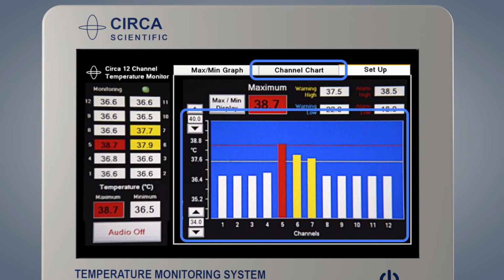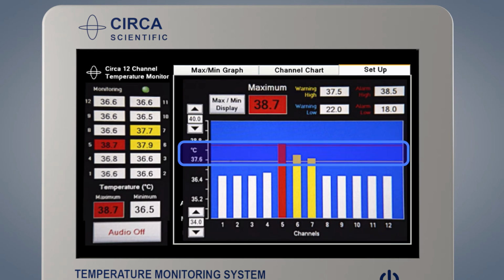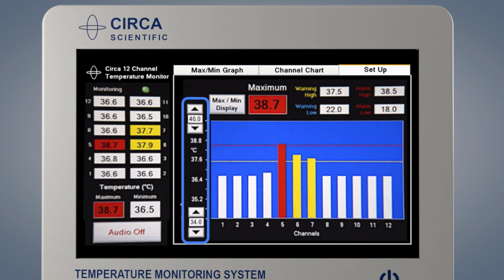Sensor 1 is the most distal sensor, which is closest to the stomach. Sensor 12 is the most proximal sensor, which is closest to the mouth. The Channel Chart graph also displays the current warning and alarm settings by yellow, blue, or red lines on the graph. The sensor temperature display and the corresponding bars change colors as temperatures reach warning and alarm limits. The scale of the graph may be adjusted using the up or down arrows on the y-axis of the graph. The individual temperatures are displayed numerically along the left side of the screen.